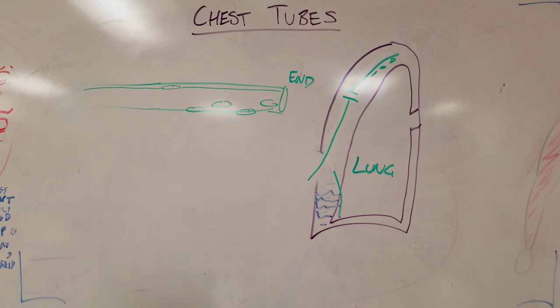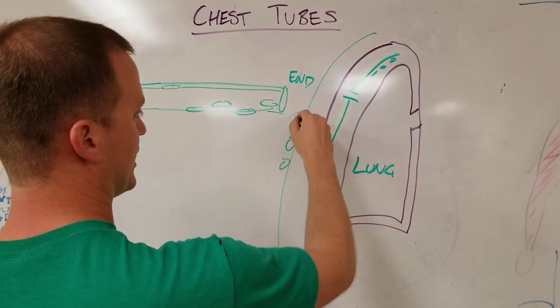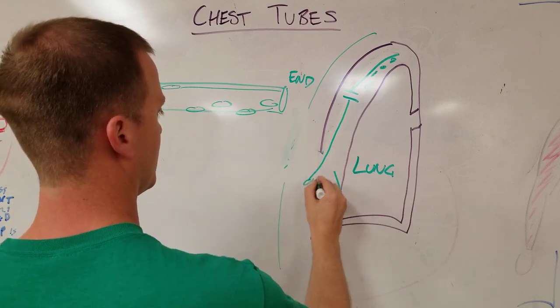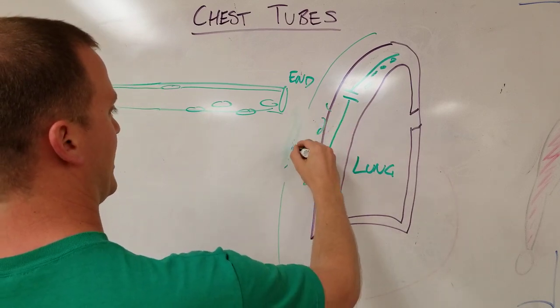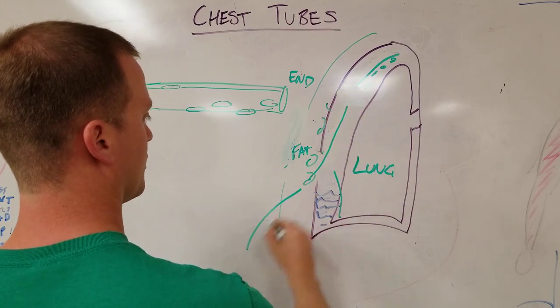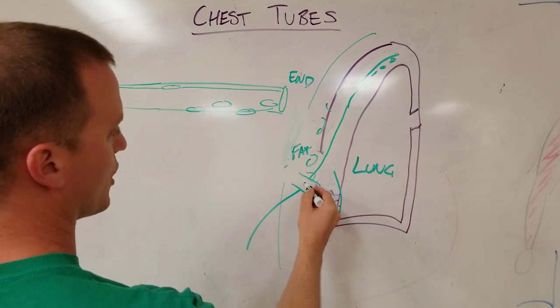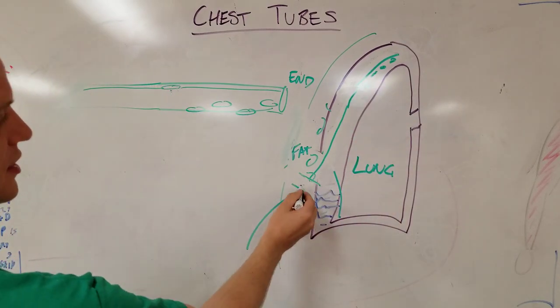If, for example, this was the subcutaneous space, and this was like the chest wall or something like that, chest wall would be here, and this would be a whole bunch of fat. If your break in your radiopaque line is here, then you know that, hey, one of my holes, my sentinel hole, is in the sub-Q tissue.